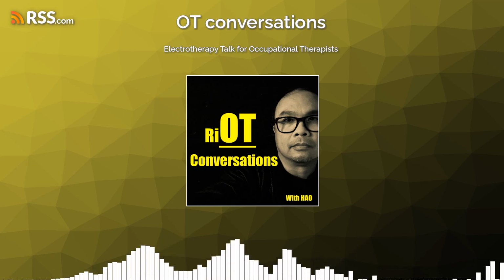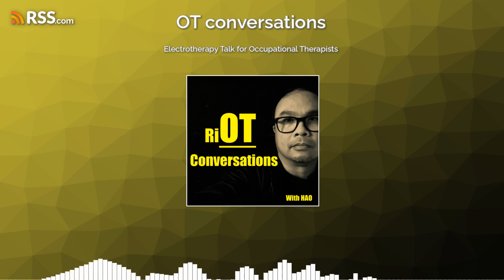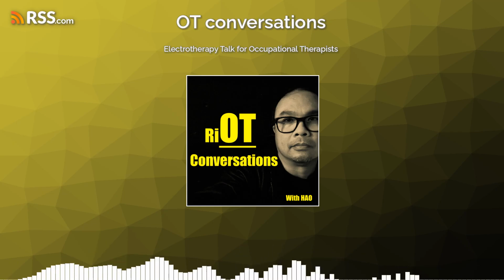In terms of applications for electrotherapy, how do we want to use this? First and foremost, you want to use electrotherapy for pain management, for conditions like arthritis, fibromyalgia, sciatica, and for those injuries, acute injuries like sprains, muscle strain. Yeah, very helpful. TENS in particular.